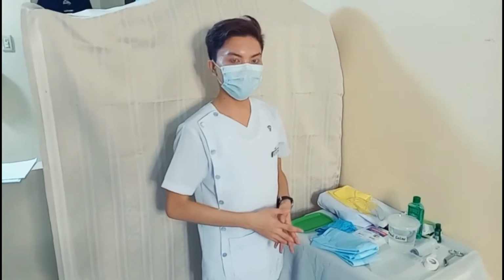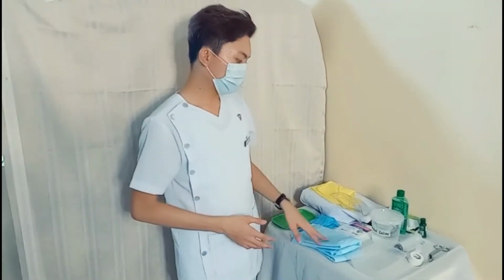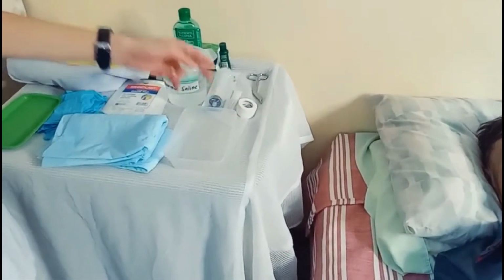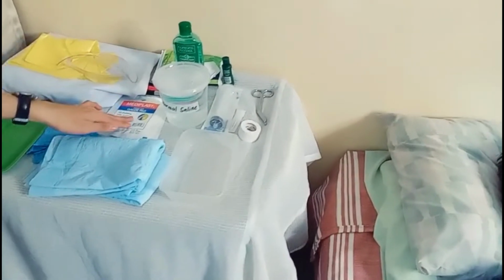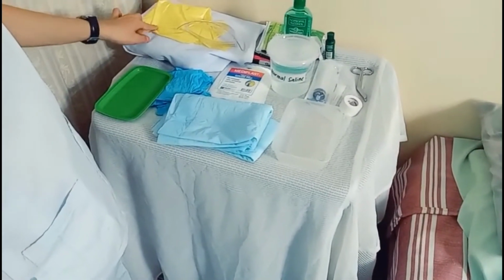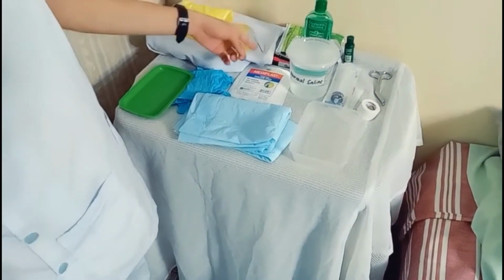Number 4, gather appropriate materials. This is done to promote organization and proper body mechanics. Thus, this is to conserve energy. Prepare the necessary equipment: the water pad, the kidney basin, the tape, the surgical scissors, the normal saline, the gauze pad, and also the PPEs, the hazard bag, and also the alcohol and the pens.